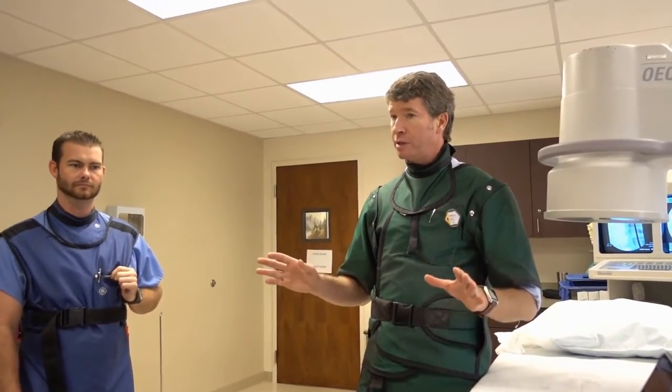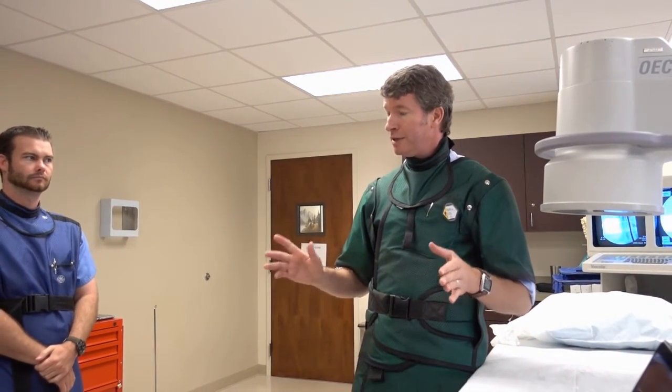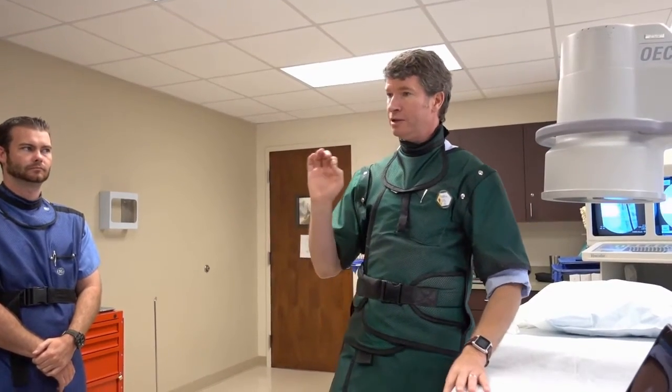The next thing is when we do a knee injection. Generally, if we're in this room and we're doing a knee injection, the purpose of the knee injection is a diagnostic injection. And the reason we're using the x-ray is to know, beyond a shadow of a doubt, that the needle is in the joint.